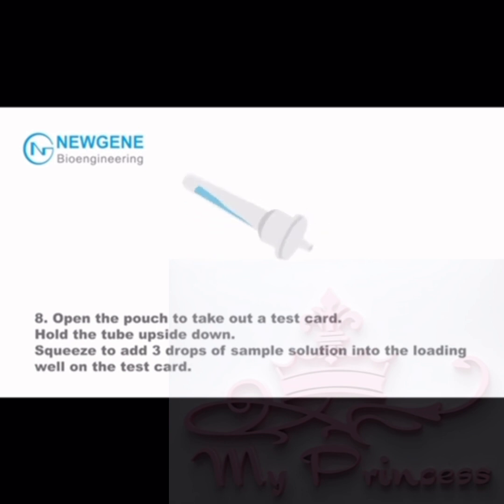Step 8: Open the pouch to take out a test card. Hold the tube upside down and squeeze to add three drops of sample solution into the loading well on the test card.